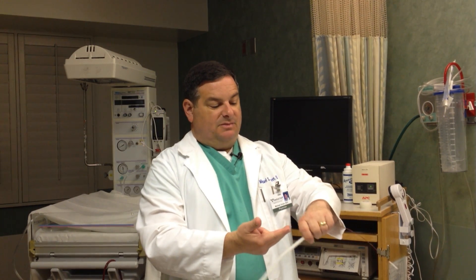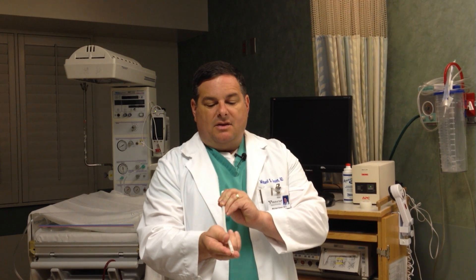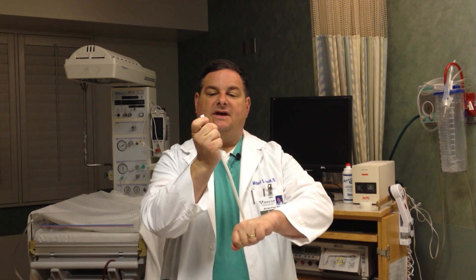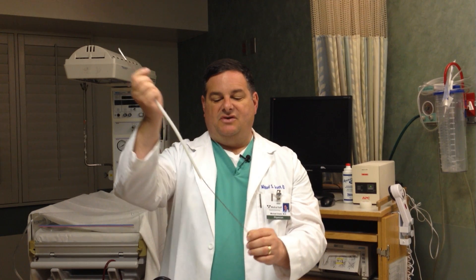The way this is used: the doctor or nurse will place their fingers in your vagina up against the baby's head. The fetal scalp electrode will then go up against the baby's head and be placed on the scalp. It'll be pushed down and twisted — it's designed to stick to the baby's head. The delivery device is then removed, leaving a little wire. This wire will be coming out of your vagina and hooks up to the machine, which tells us a lot about the baby.